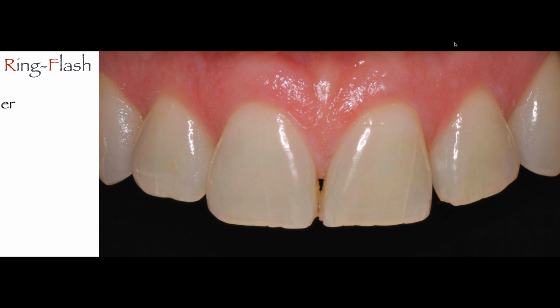And I'm going to show you a couple of shots so that you can see what the difference is. So I'm going to show you this photo. And this is a good photo. It's a high quality photo. This photo was actually taken by Dr. Halo. He's used his black contraster very well. We can see the nice pink tissue. We can see the teeth. We can see every single detail.